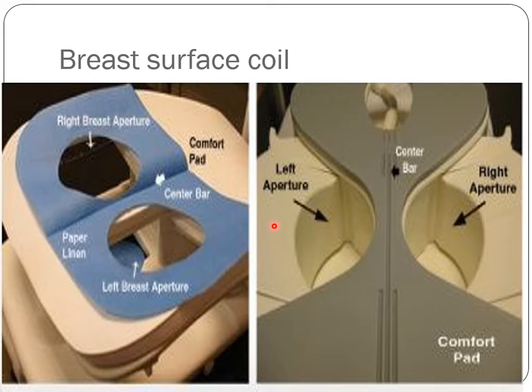You need a 16 or 18 channel MRI machine and a 16 or 18 channel MRI coil, breast coil, surface coil, okay? You can have an 18 channel MRI with a 4 channel coil. You can do that. A 4 channel coil will work with a machine of 16 or 18 or 12 or 8 channels, no problem. But you cannot have a 12 channel coil on a 4 channel MRI, okay? So the machine should have a number of channels equal to or more than the coil.